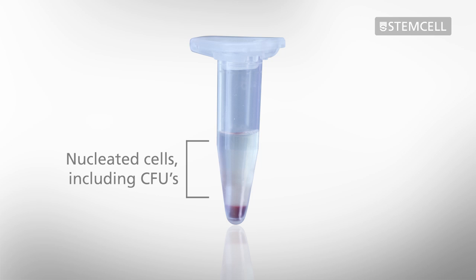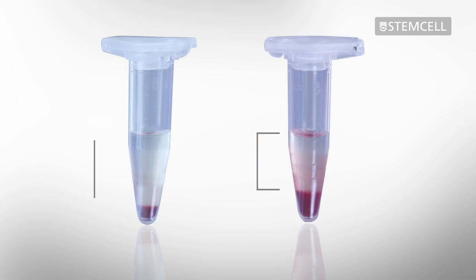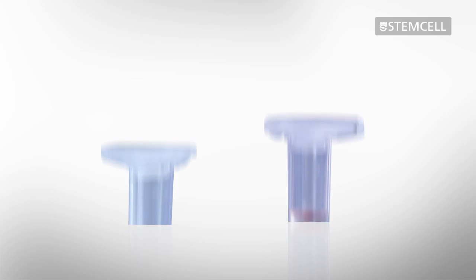The upper phase of the separated sample contains the nucleated cells, including the CFUs. Please note, the color of the upper phase may be more or less pink depending on the sample type.